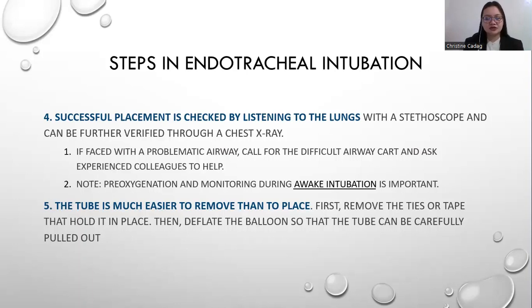So before extubation, when the patient is almost weaned off the sedation, you need to explain to the patient what is going to happen, so that he will be able to prepare himself mentally.